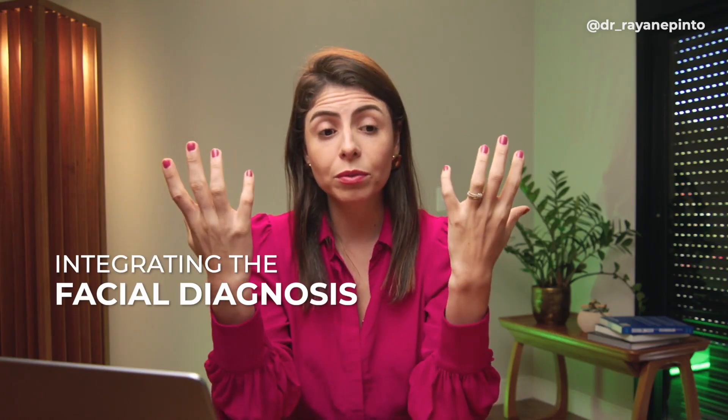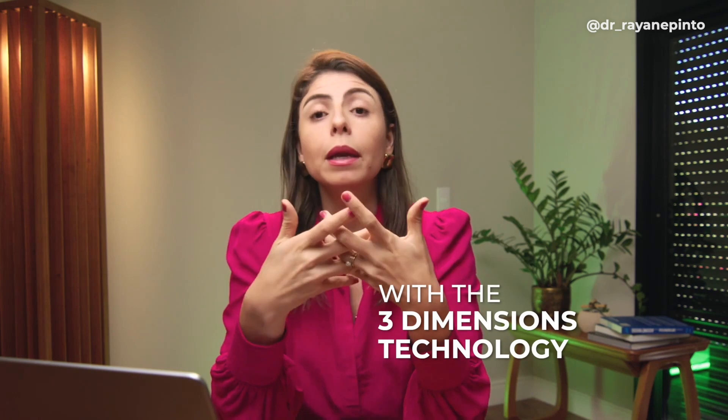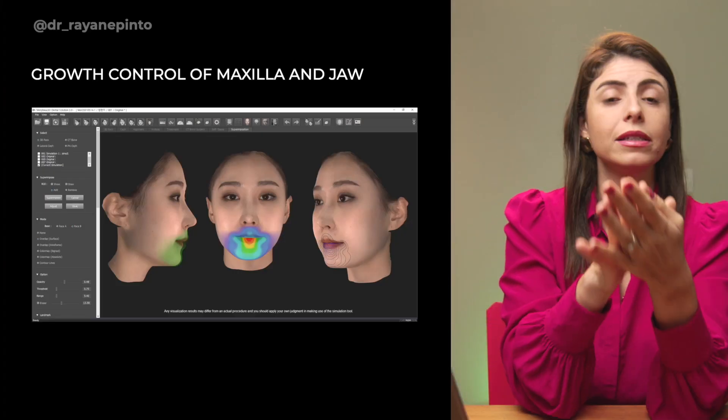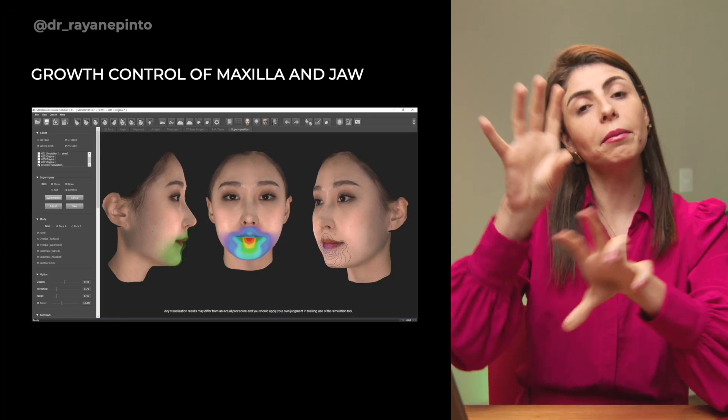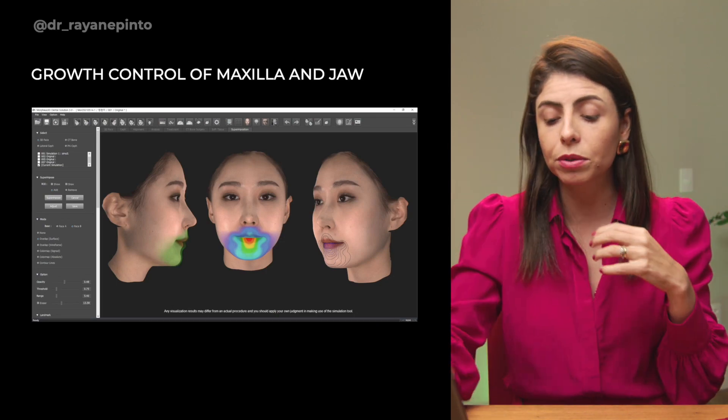It is now possible to integrate facial diagnosis — something very relevant and important — with three-dimensional technology. It is also possible to make several records and obtain color maps to know where growth is occurring, whether the maxilla is growing more or the mandible is growing more — a complete analysis of growth. And one last feature we can discuss in another video is the possibility of integrating the CT scan with the facial scanner, which is already the highest level of technology.